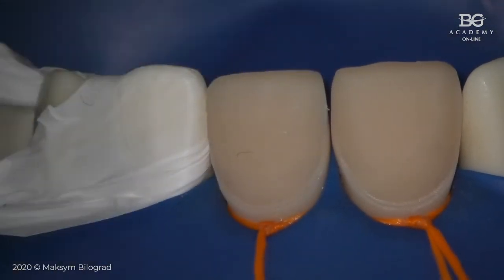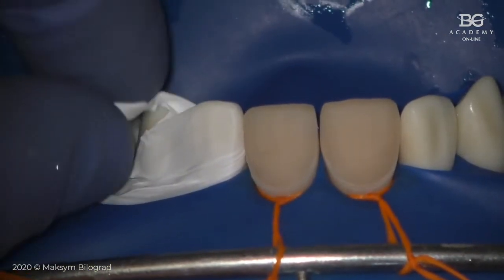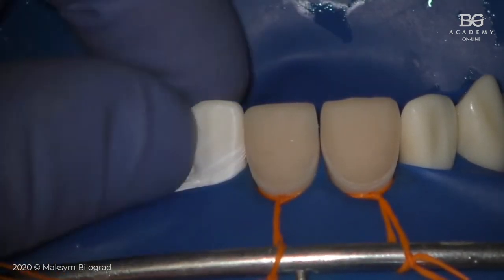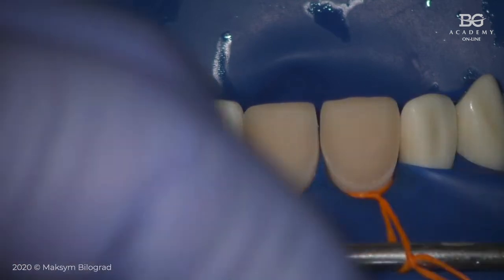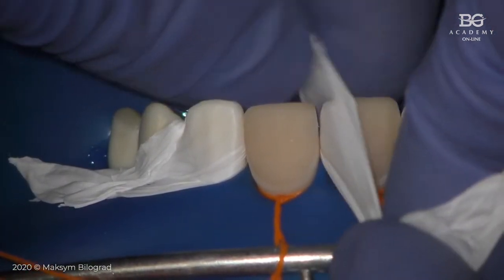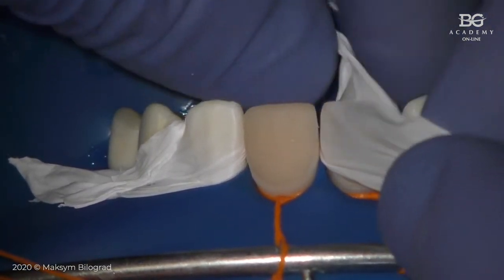For this we can use really simple technique, which is Teflon. Teflon is really thin. Teflon is not compromising fit of your veneer interproximally, and especially for this tooth, Teflon will protect adjacent tooth from bonding. I don't want to contaminate my adjacent tooth with bonding. That's why I will put some Teflon.